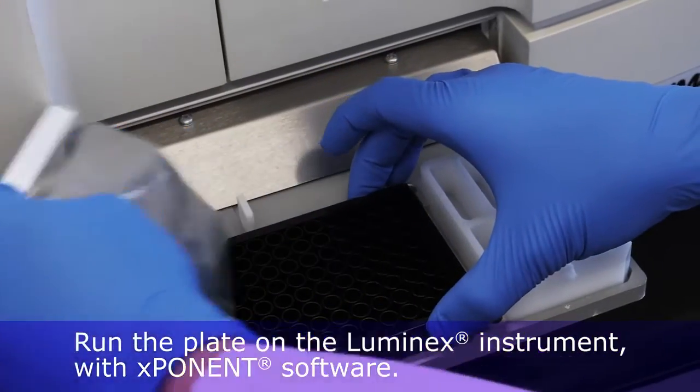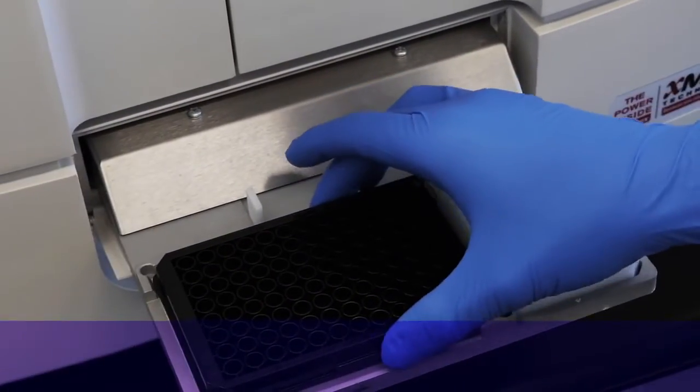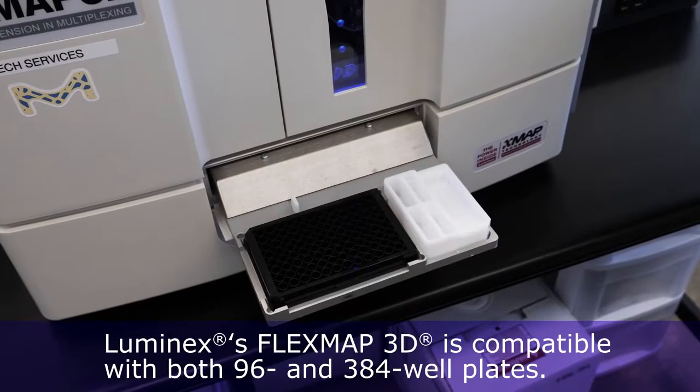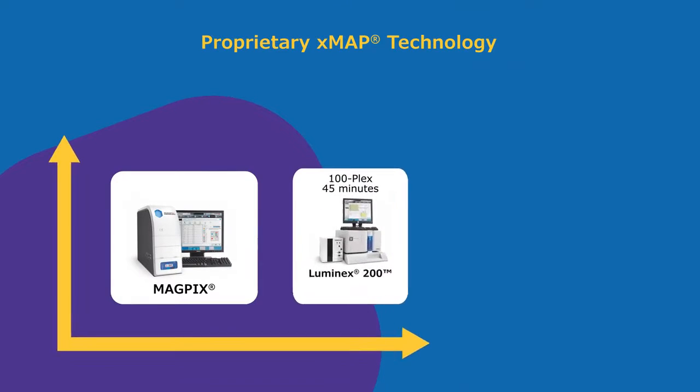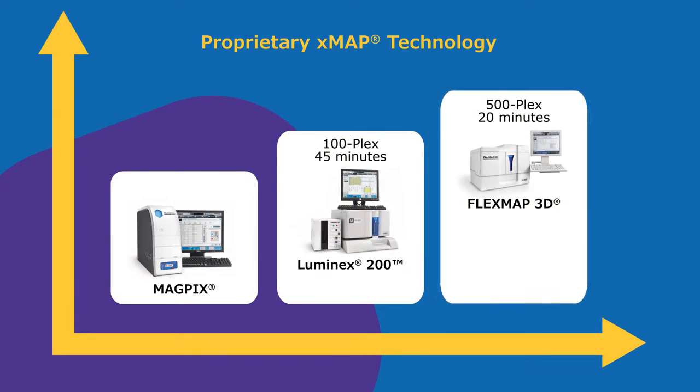Run the plate on the Luminex instrument with xPONENT software. Luminex's FlexMAP 3D has a fast read time and compatibility with both 96 and 384 well plates. The Luminex 200 and FlexMAP 3D have high plexing capabilities compatible with higher-throughput applications.